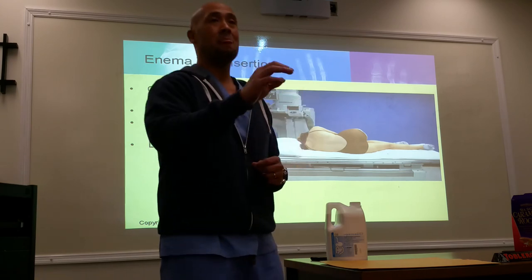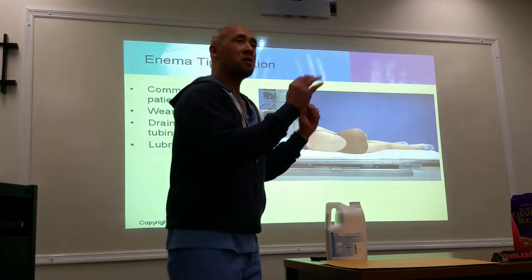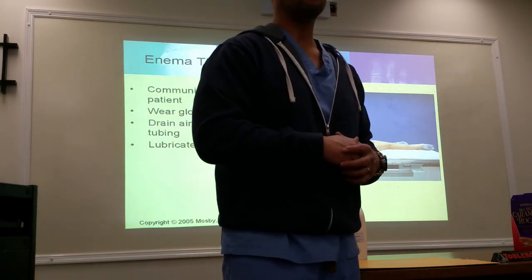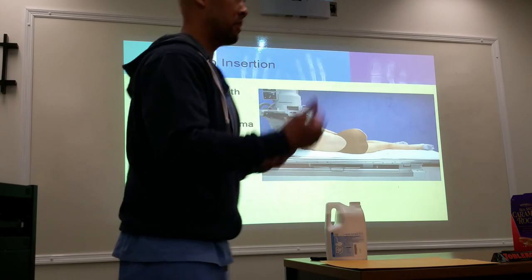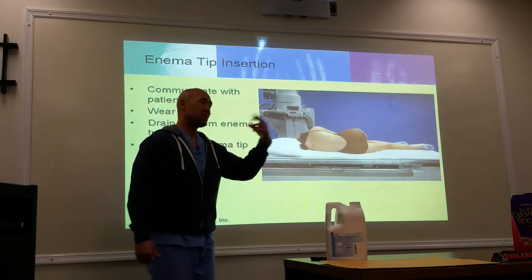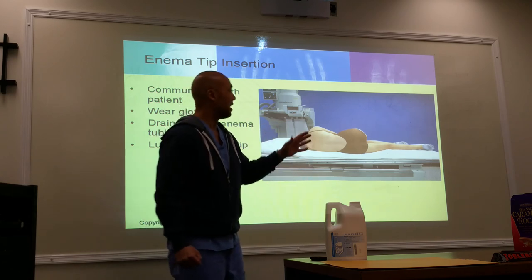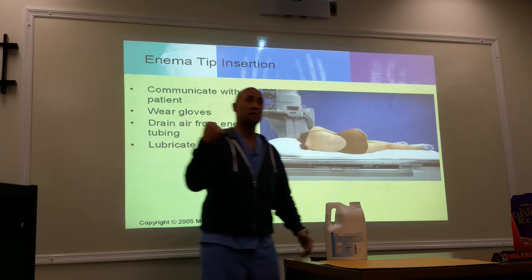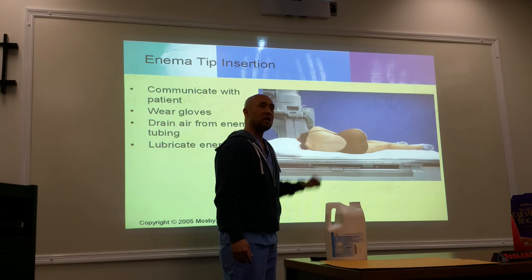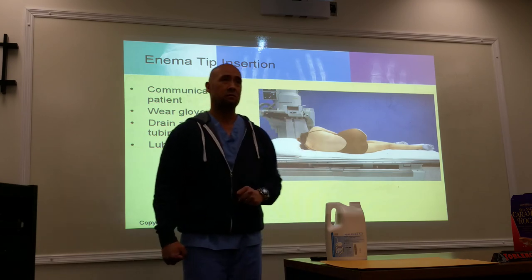and when the doctor is done, this is where it may change, because it depends on your hospital. When the doctor is all done, then I have my own set of pictures that I need to take. Do you have any questions? And then we go from there. So after I've done the explanations, I ask them, do you have any questions? Do you have any concerns? That's the best time to do it, while they're sitting up at the edge of the table, you're having a conversation. If they don't have any questions, then you say, okay, I need you to lay down on your back, and I need you to turn your backside to me.